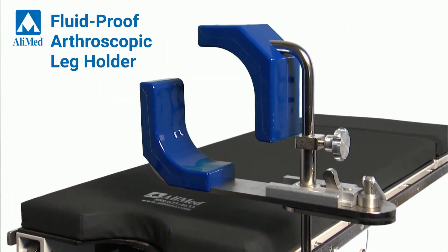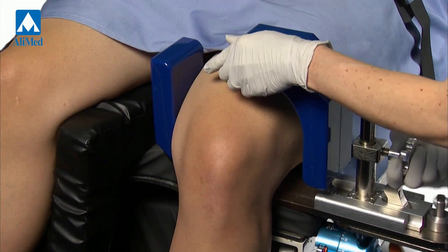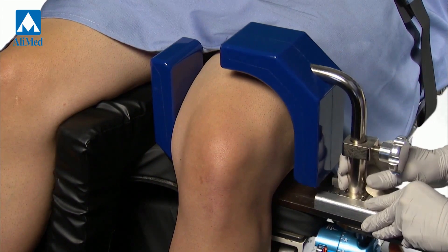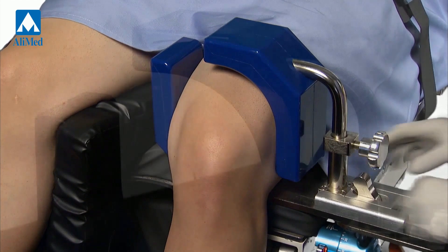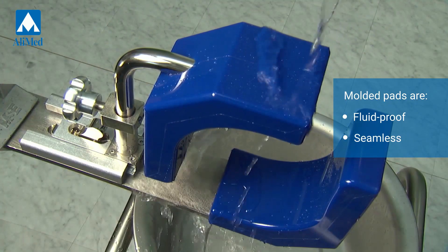The Alimed fluid-proof arthroscopic leg holder takes a tried-and-true reusable design and adds enhancements to resist cross-contamination hazards. The firm, molded urethane pads provide stability and are fluid-proof and seamless for easier cleaning.